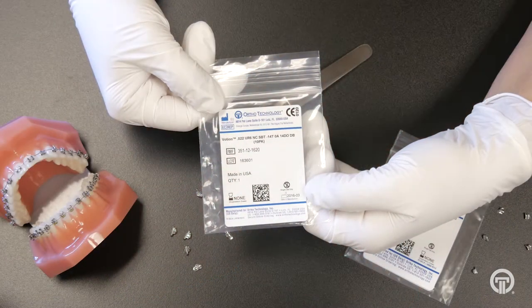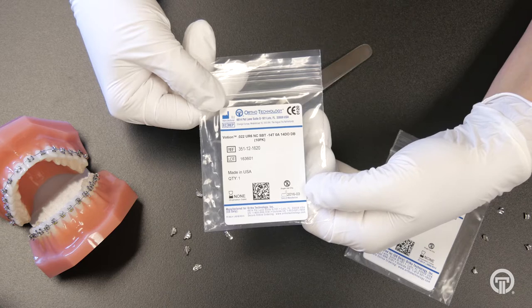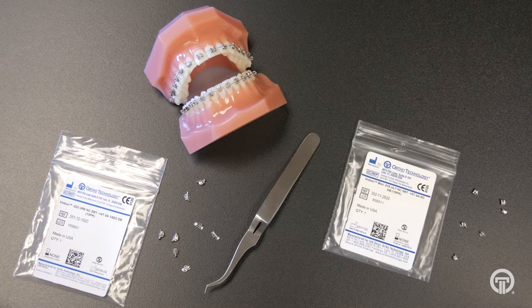The Votion Buckle Tubes are sold for first molars as well as second molars. Each quadrant is sold in packs of ten. We do run a lot of promotions and deals on the Votion Buckle Tubes, so please contact your sales representative for more information.